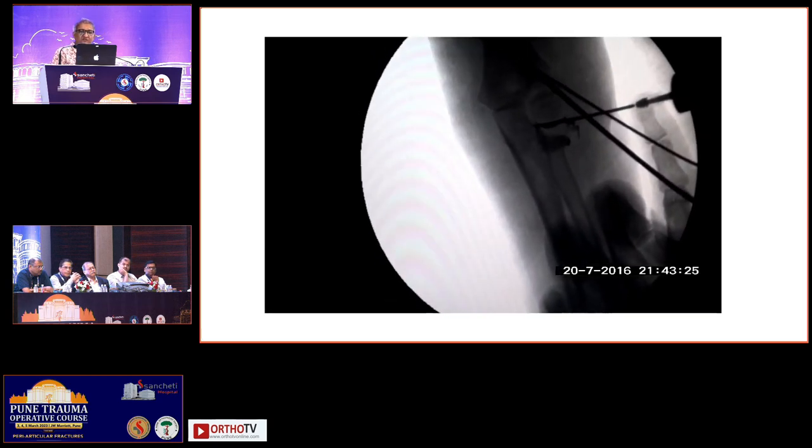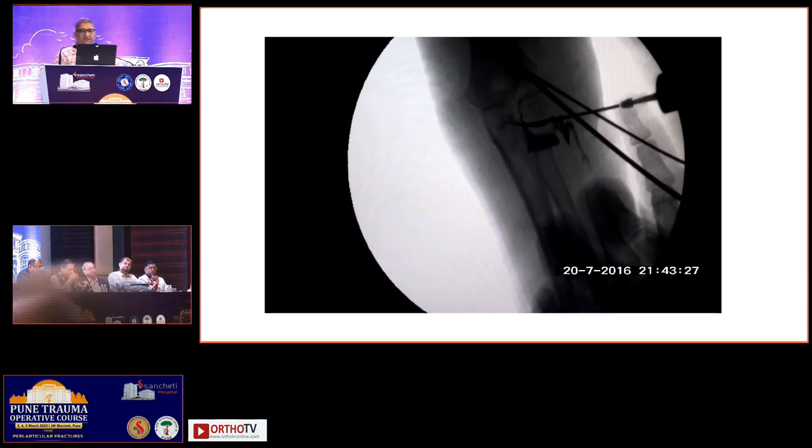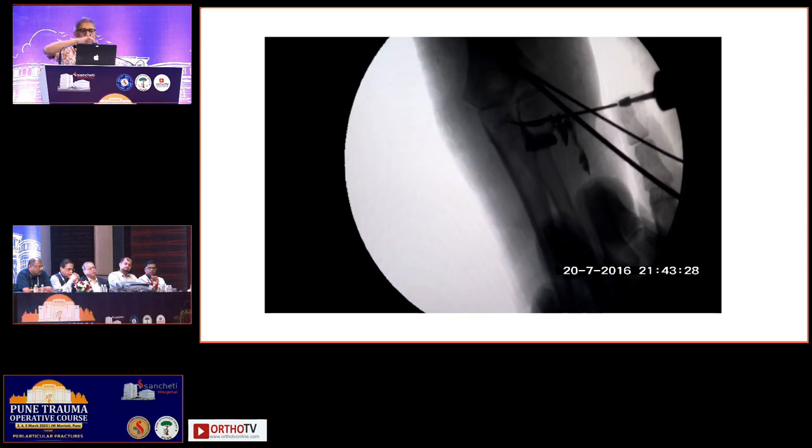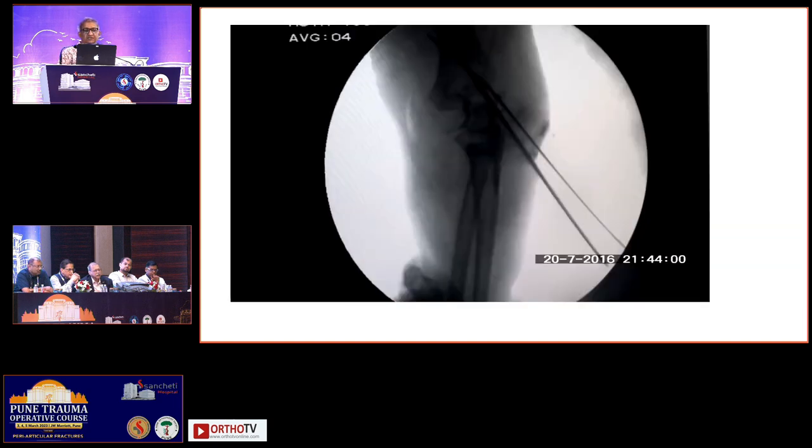So this is putting the dye, and as you push, it shows you that the articular surface is now in good shape. Of course, it is not going through the fracture site. What you see, the vertical limb, that is the trochlea. So this shows you that it is not going through the fracture. It is delineating the articular surface very well. So I know that my reduction is proper. You see it in AP, lateral and oblique views.